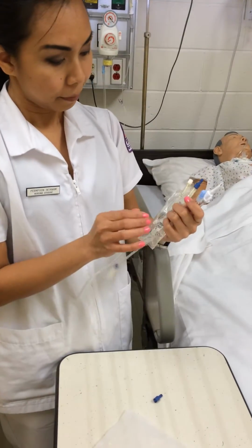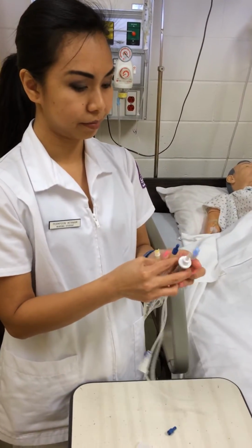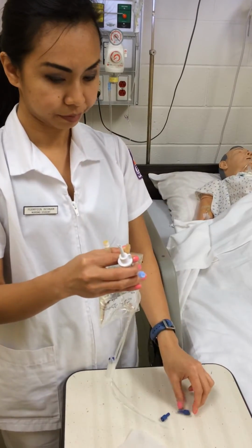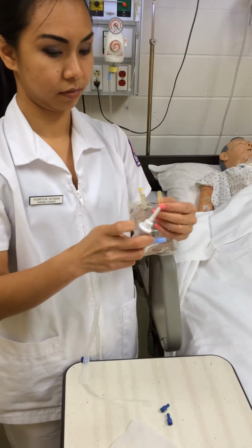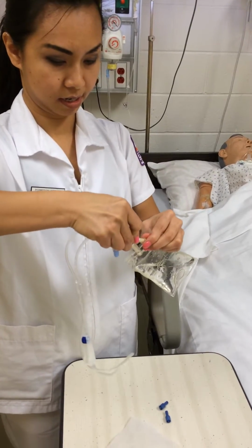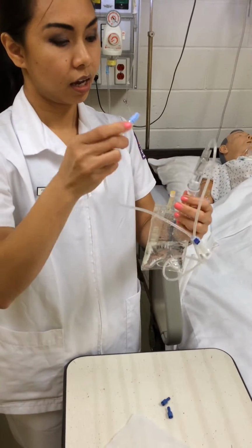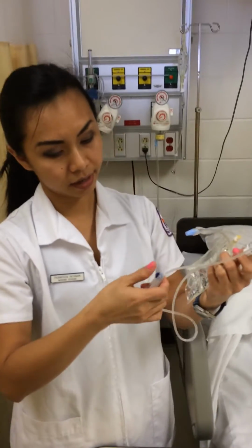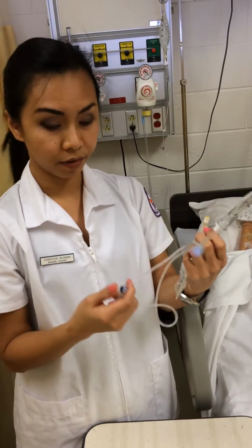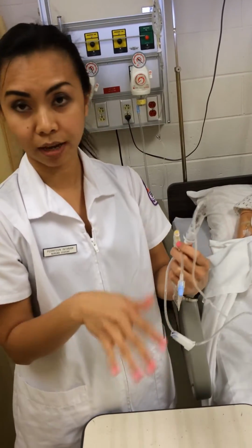This is sterile, so I open it and I clamp it. I make sure the tube is clamped so the medicine does not come out.